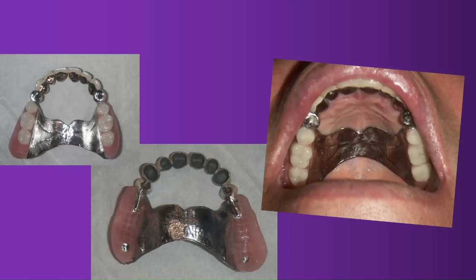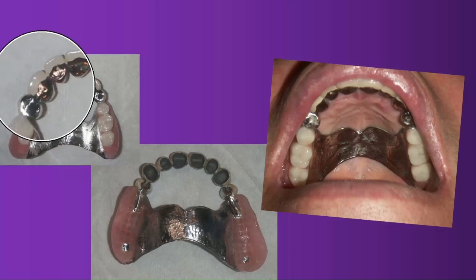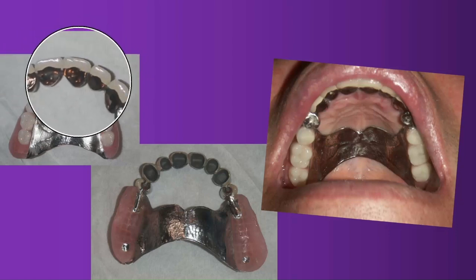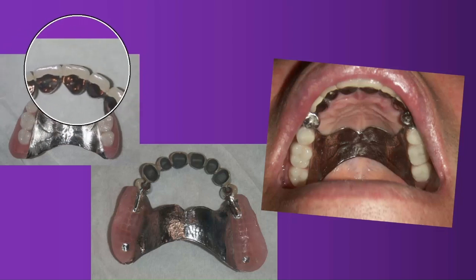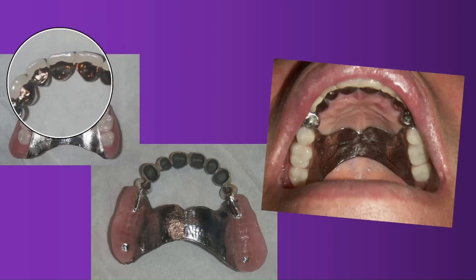See, this is what I'm talking about. This has been changed after 17 years. So it lasted for 17 years. You see the front canine to canine. Another colleague said, no, these teeth have to be extracted. Okay, 17 years, and now we extract them. 17 years later. That's crazy.